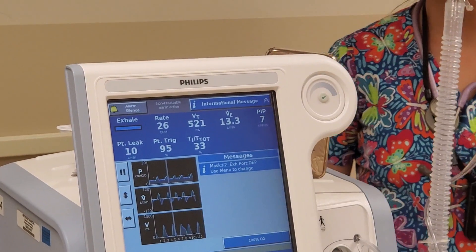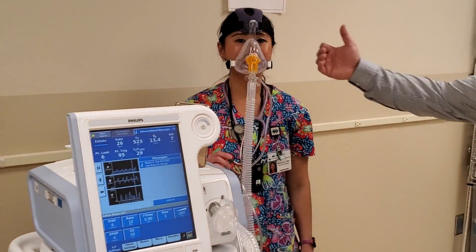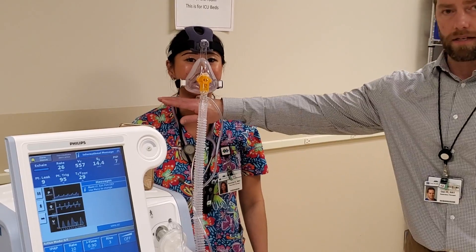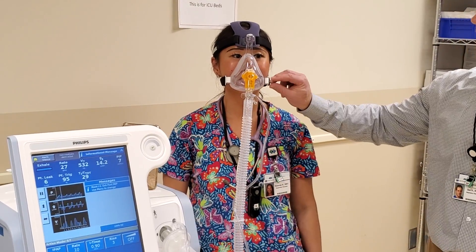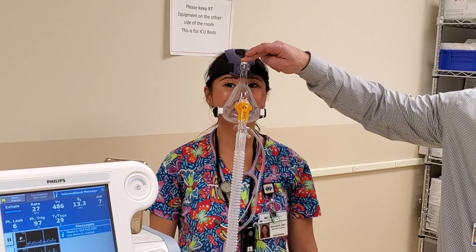That number will fluctuate but we seem to have a good fit. If the leak is too much, you can run your hand along the mask like this, feel for a leak, and then tighten it up — either here, or if it's up here we can move this back and forth by pressing this button.